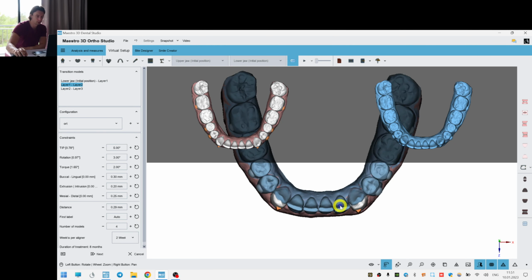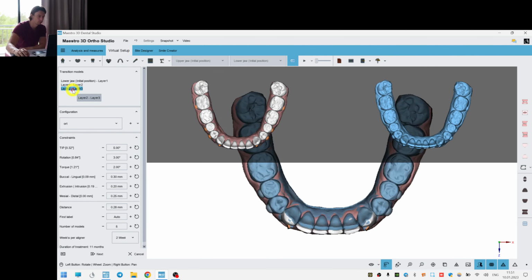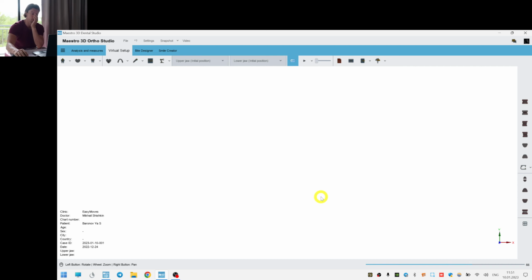So here we're moving the canines lingually. It can be done a bit faster. Let's check the rotational degree. 0.77, it's fine. And here's some intrusion of 0.19. Let's reduce it. I think it should be a good idea. And let's reduce this amount as well. So we get 24 aligners for the lower arch.